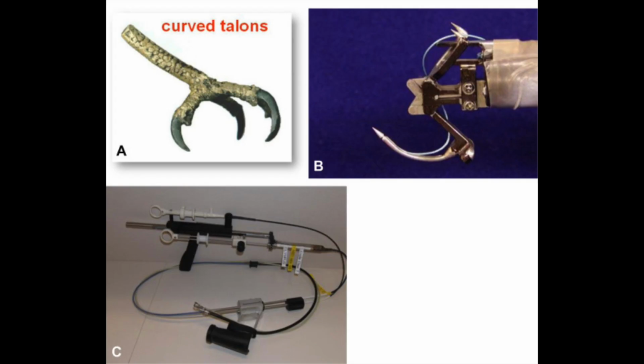Yeah, no, I will. It is a long road and a lot of just incredible innovation that went into it over many years. The original designs go back to the group I mentioned and Dr. Sidney Chung. The very first version of Overstitch was called the Eagle Claw. And it was the concept of an eagle's claw that got the curved needle that now is integral to the Overstitch device, for those who are familiar with it. They worked with Olympus, funded their research for many years. And it was, again, just a group of physicians doing primary research.